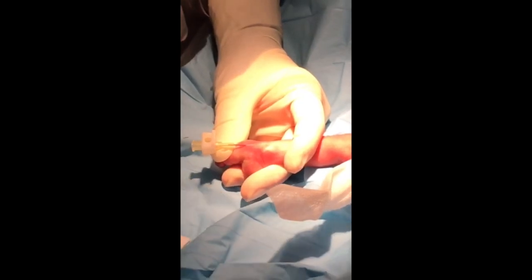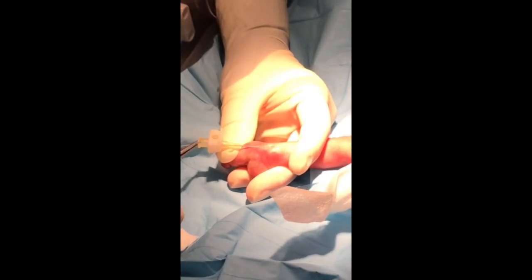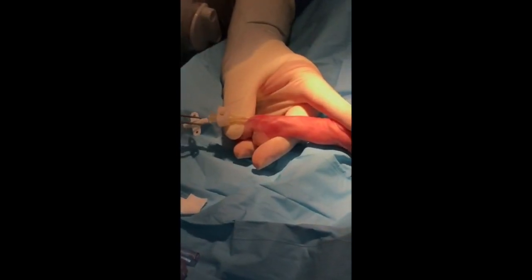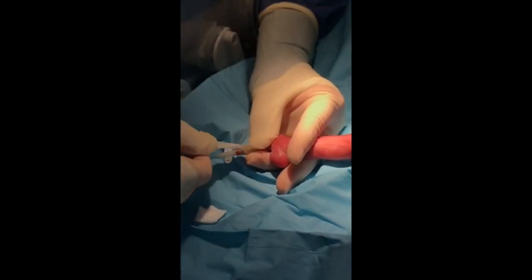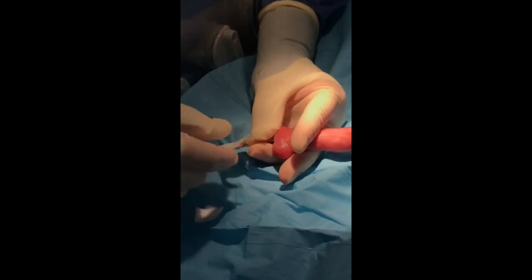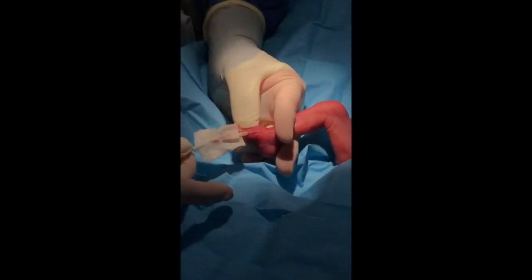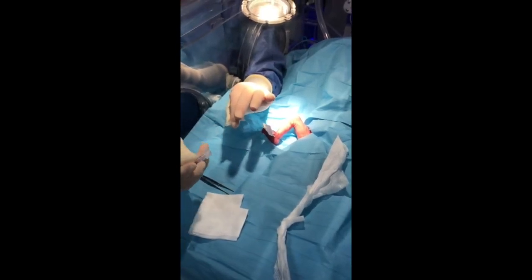You're then able to advance the catheter to the previously measured insertion distance using the non-toothed forceps. Sometimes, as in this case, it may be necessary to insert the entire catheter into the vein. If this is the case, it is often easier to secure the catheter to the cannula using steri strips to prevent kinking of the PICC line at that site. The stylet can then be removed and disposed of.